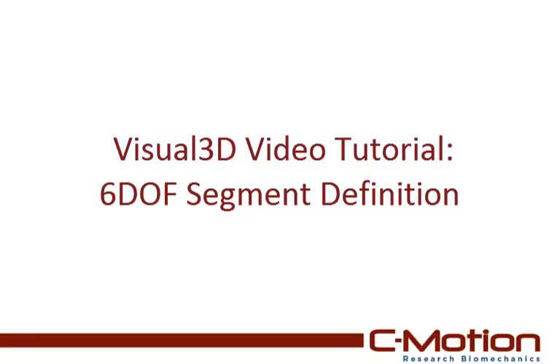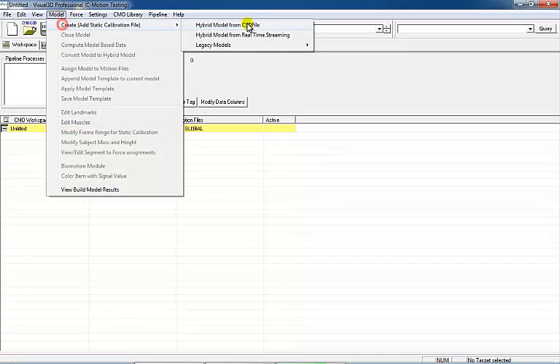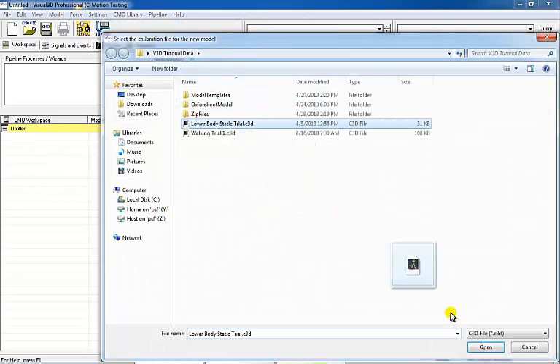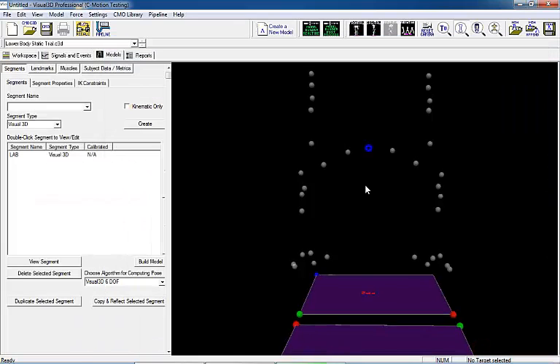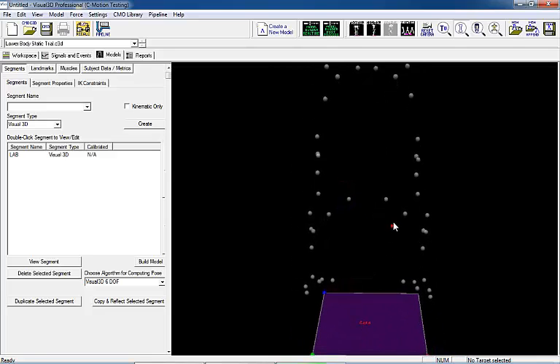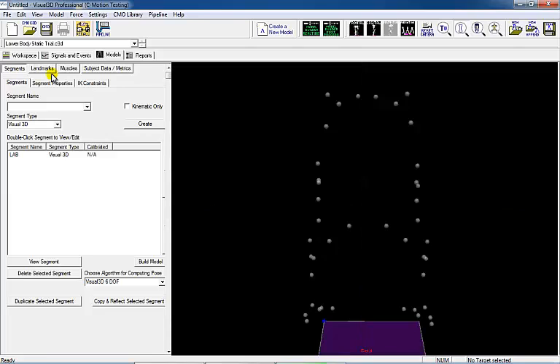In this tutorial, we're going to define the shank segment in four different ways. How the segment is defined will affect the definition of the segment coordinate system. For the shank, the definition of the segment coordinate system will affect the internal-external rotation of this segment. Although we are just looking at the shank, the same principles will apply to other segments as well. During this tutorial, keep in mind the correct definition of a segment is dependent on the user's end goal.